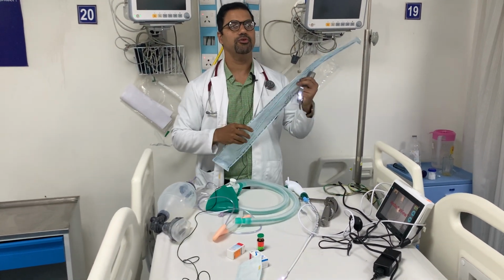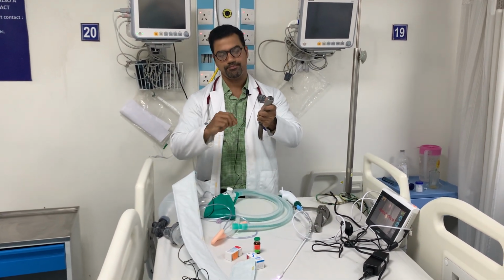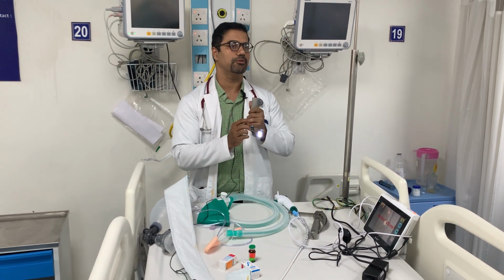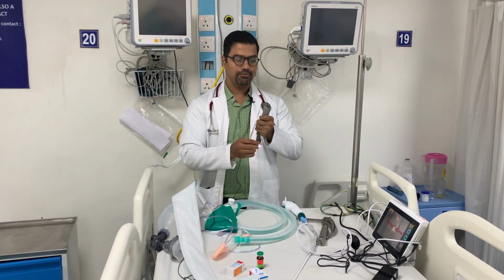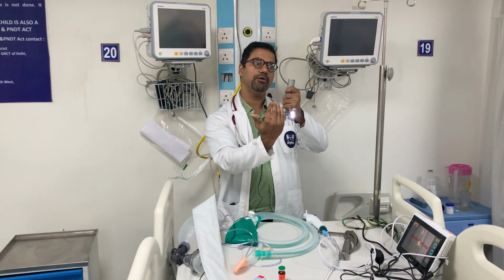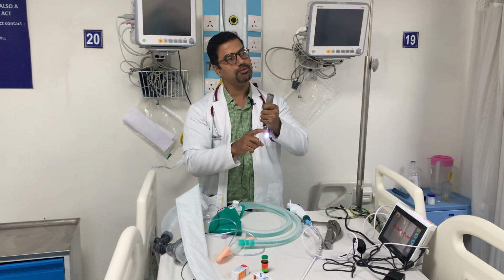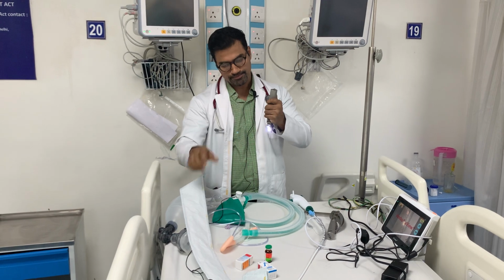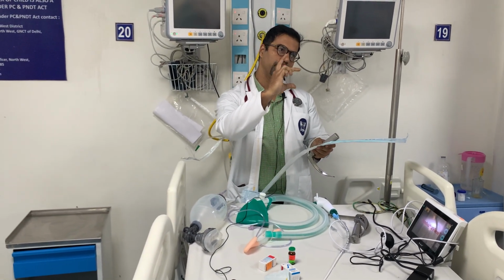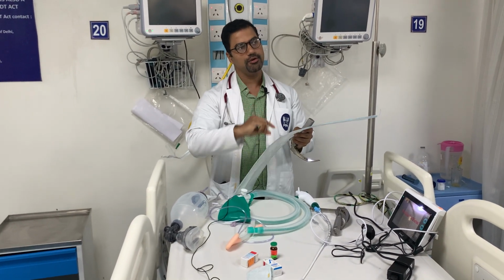The second accessory that you have is the bougie. What you do is just push the laryngoscope, see what should be the position of the tip of the laryngoscope. When you go inside, once you see the epiglottis, you should go and then it should be at the tip of the vallecula. Okay. So this should be the position of the tip of the laryngoscope. Now what you can do is, if just the anterior part of the vocal cords are visible and the posterior parts are not visible, you can use the bougie and then railroad the tube.